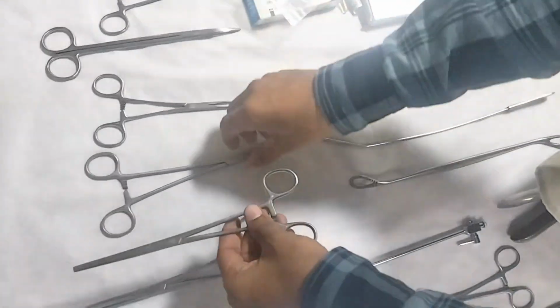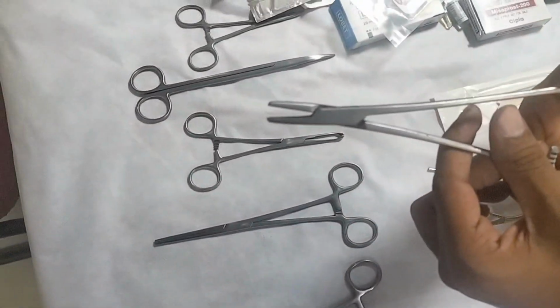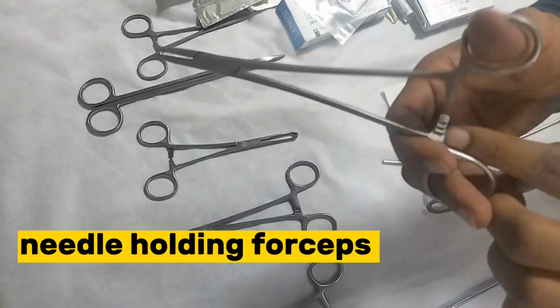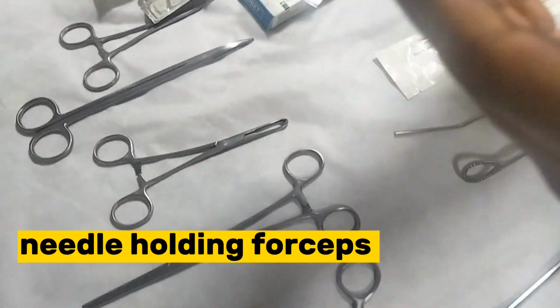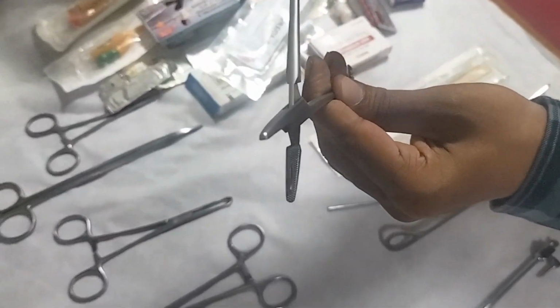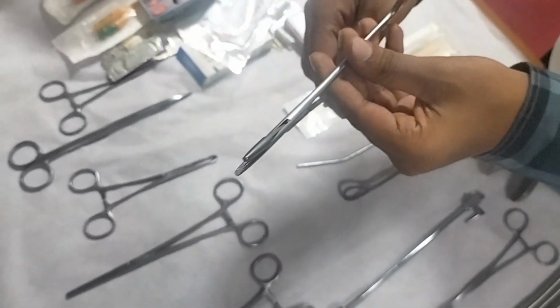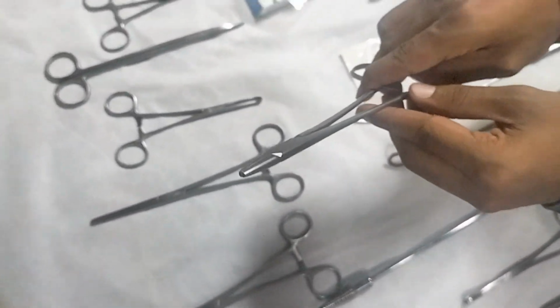Next. This is a needle holding forceps. Okay, you can see ratchets are there, finger rings and shaft joint, and the blades are smaller. And you can see there is a small groove to hold the needle. Okay, the needle is held at the anterior 2/3 and the posterior 1/3. Okay, this is a needle holding forceps.